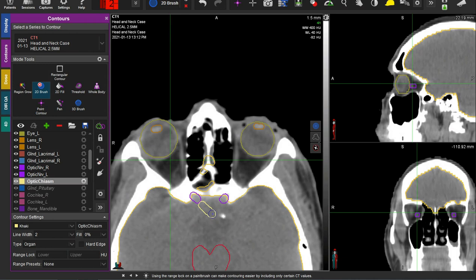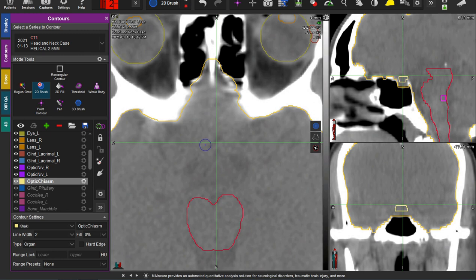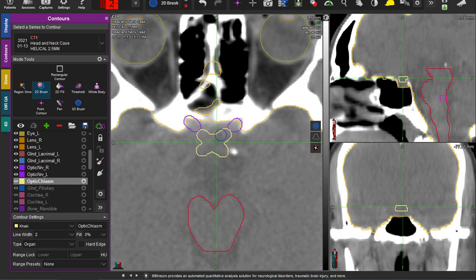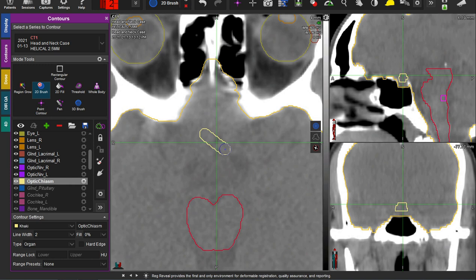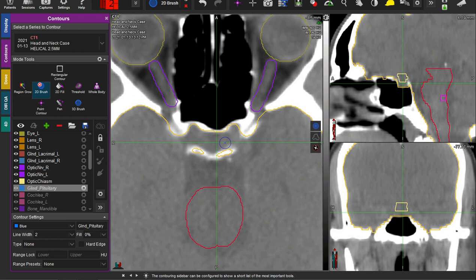A lot of times you'll see the optic chiasm drawn as a little cross. With a CT scan it is very hard to tell what the optic chiasm is — if you have struggled to tell where the optic chiasm is on a CT scan, you are not alone. That is normal; it is very hard, if not impossible, to say with confidence where the optic chiasm is. But I do know it's connected to optic nerves, so I can say it's at least here, and for security you could include one more slice superiorly. We usually use the cross shape because we see that on MRI — if you wanted to contour perfect chiasm, you'd have to fuse an MRI image.